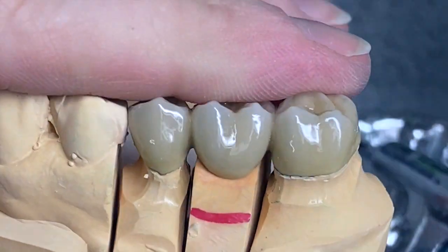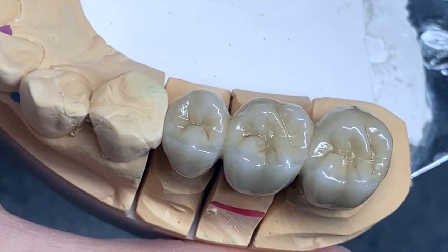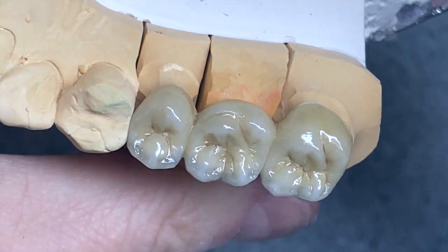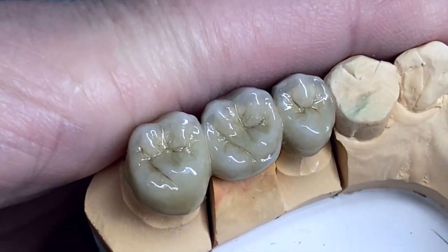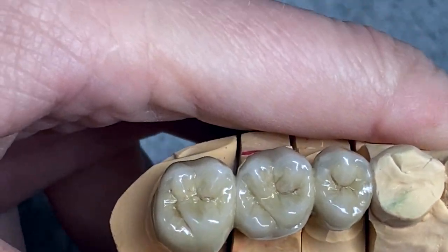So that's the bridge after glaze — that's what it looks like on the model. And that's the lingual side.